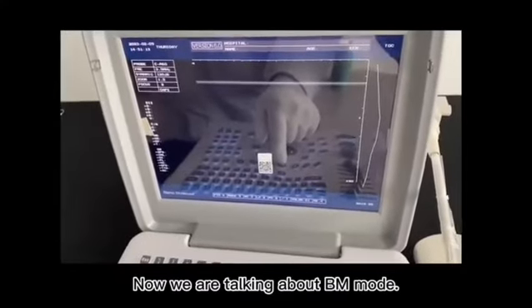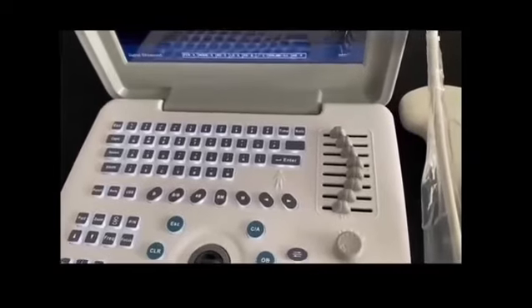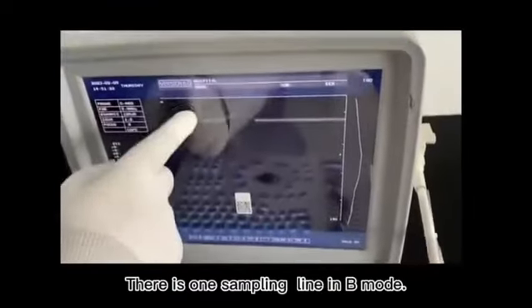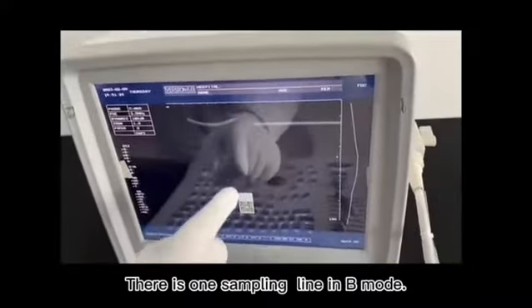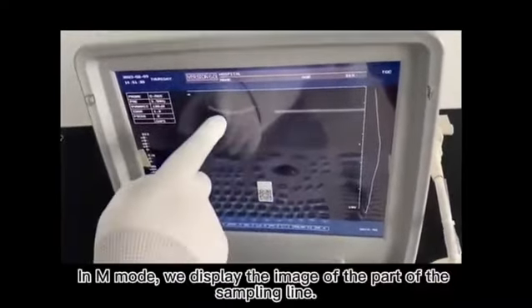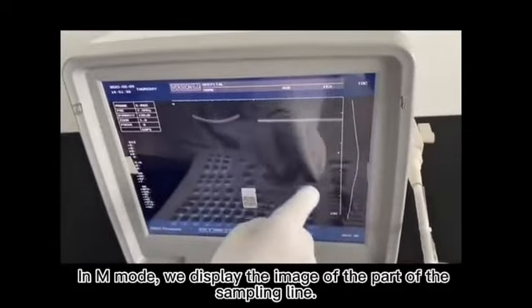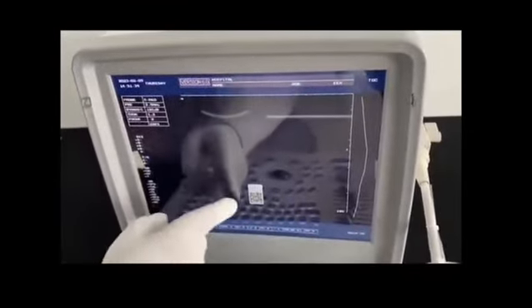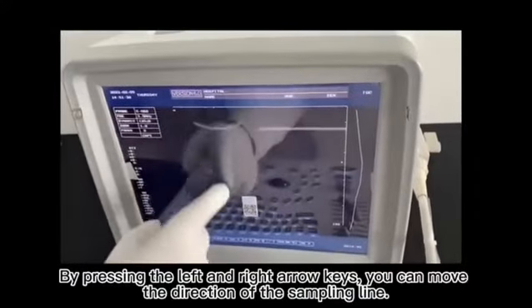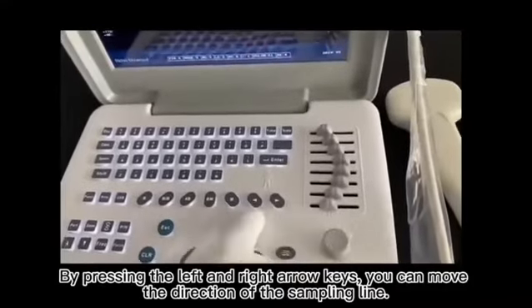Now we are talking about BM mode. There is one sampling line in B mode. In M mode, we display the image of the part of the sampling line. By pressing the left and right arrow keys, you can move the direction of the sampling line.